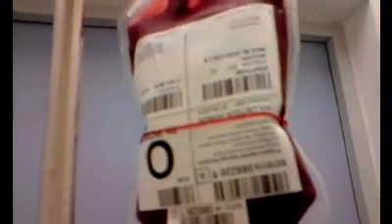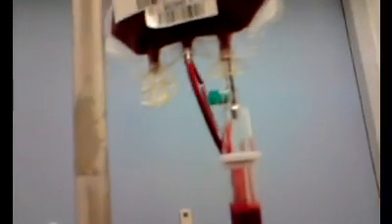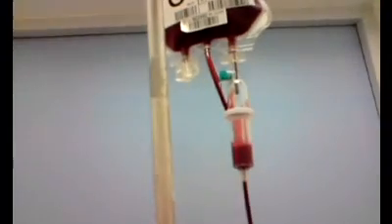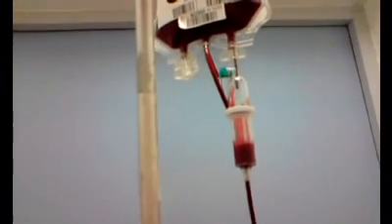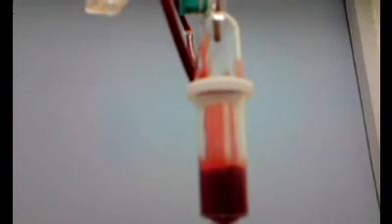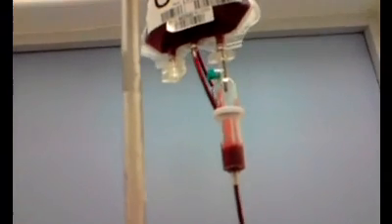Just to add: the level of this — if it's higher, the blood drip will be quicker. Because the higher your hand is, the lower the resistance. So it's like a potential difference — drops come quicker. Because I'm standing up, it's not ideal.